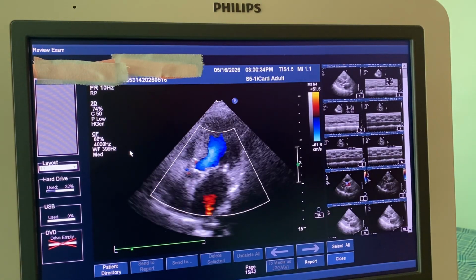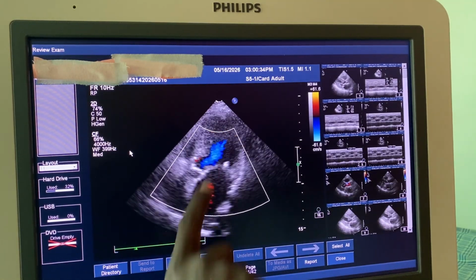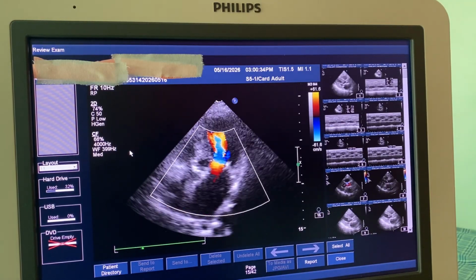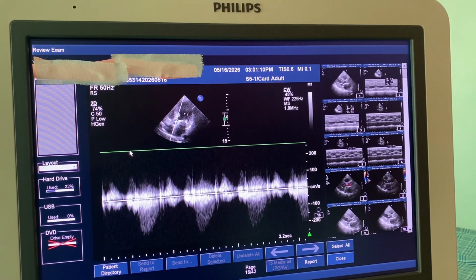So there is no regurgitation at the aortic valve, just restricted opening. Next. Now this is where things are. AS. For AS, we know there is a stenosis, aortic stenosis. What is next is to grade its severity.